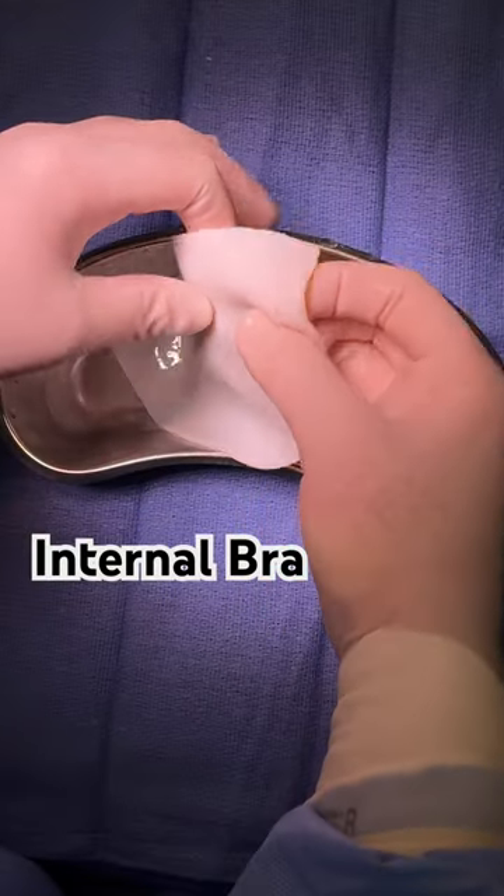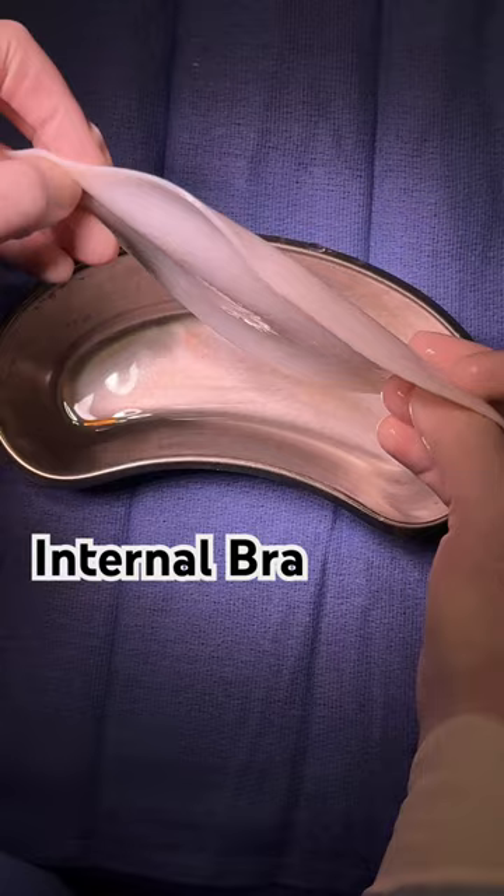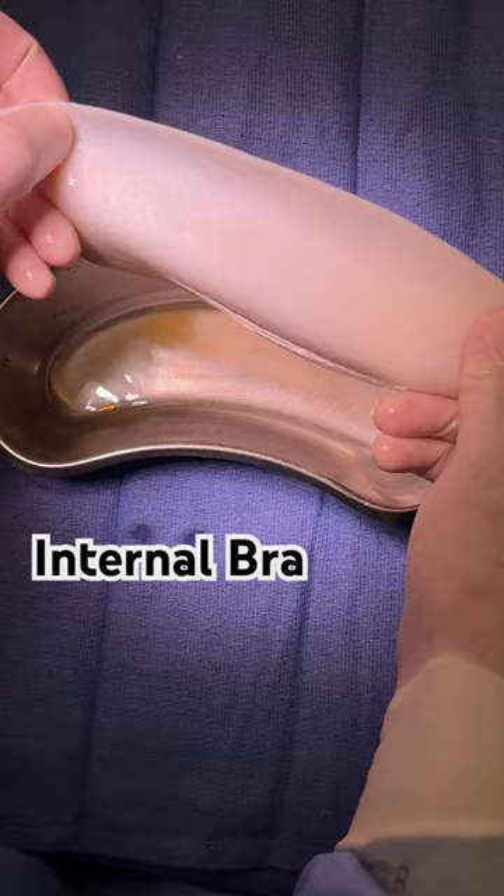So this is our internal bra today. Typically, we use Galaflex, which is a synthetic material. This is Stratus, so it's actually dermis. It has a little more pliability to the tissue. It incorporates into the tissue over time, so it actually gets a blood supply.